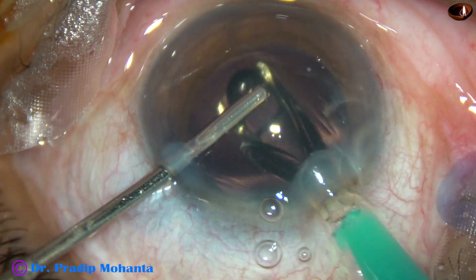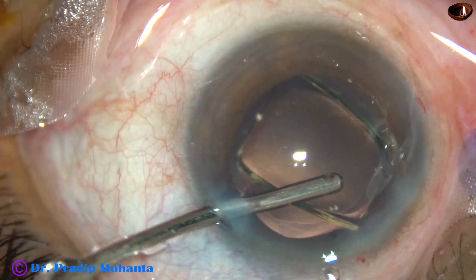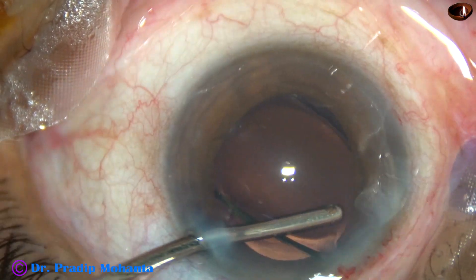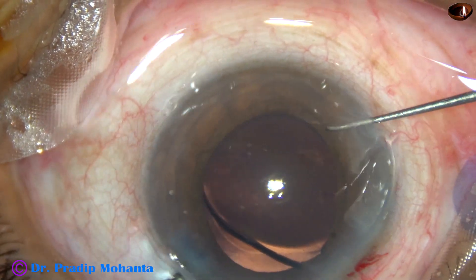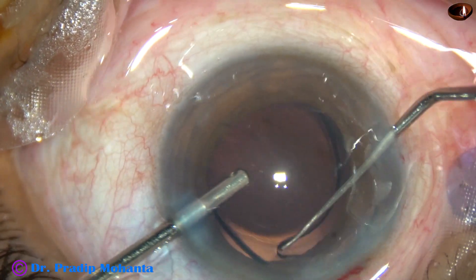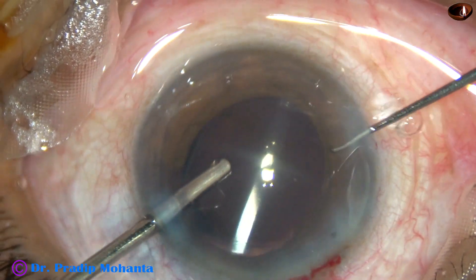This is implantation of a hydrophobic single-piece monofocal intraocular lens from Abbasi Associates — this is Superphobe, a good lens. The trailing haptic is placed in the bag using a Sinski hook.